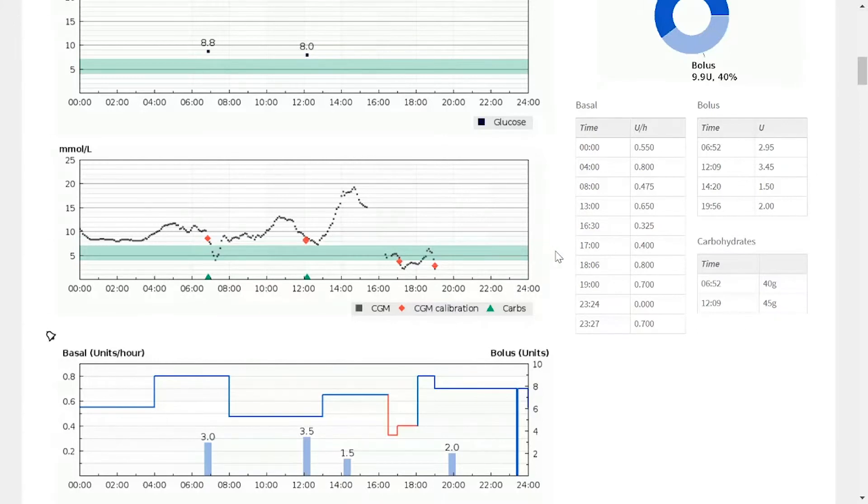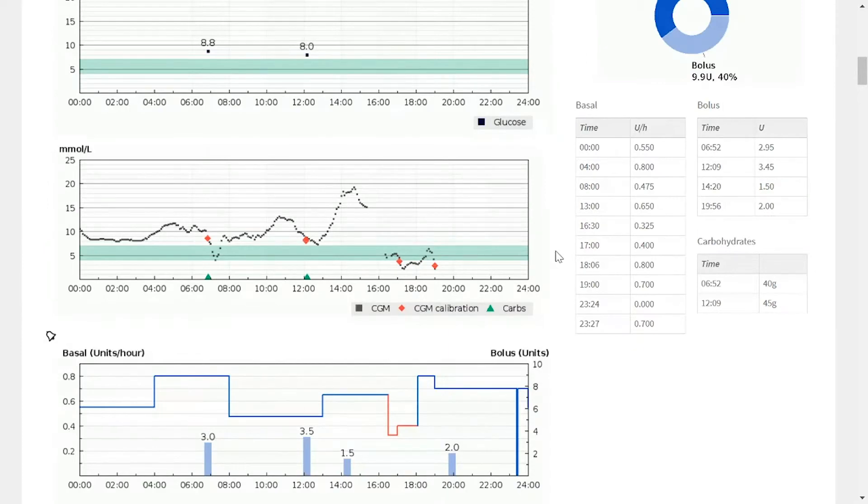If a patient is using flash glucose monitoring, you can actually see the specific scans that a patient has done throughout the day.